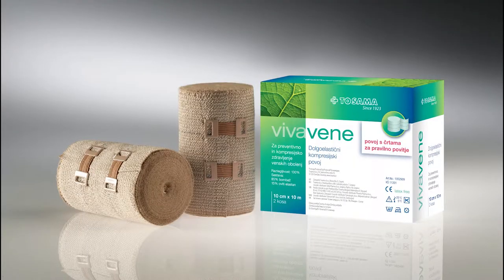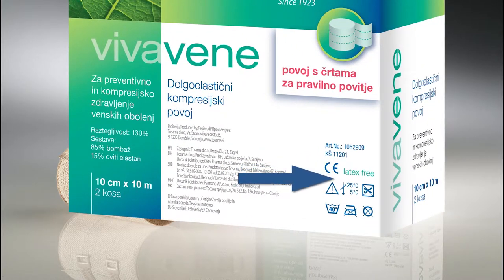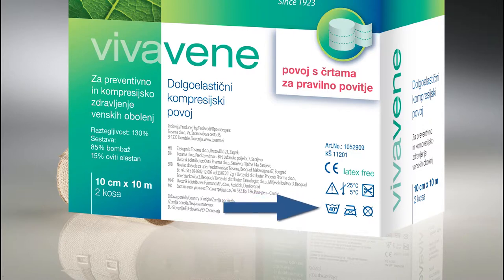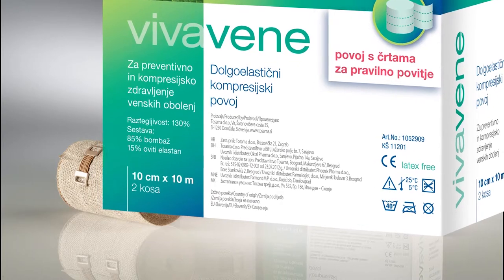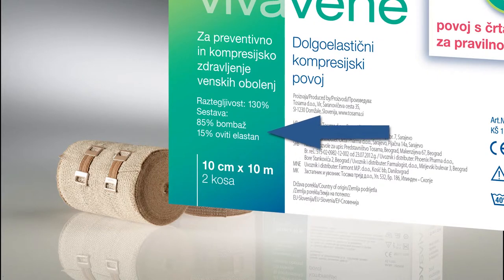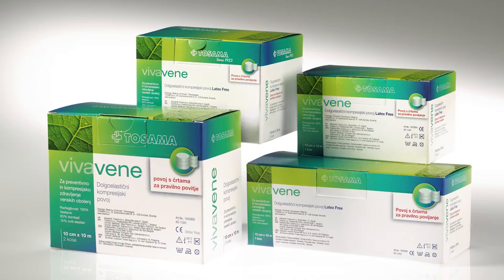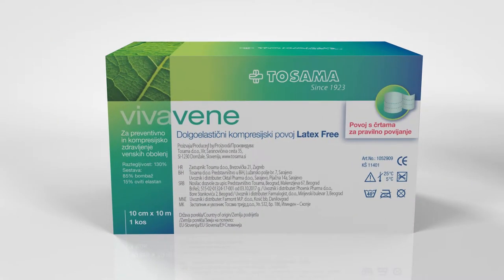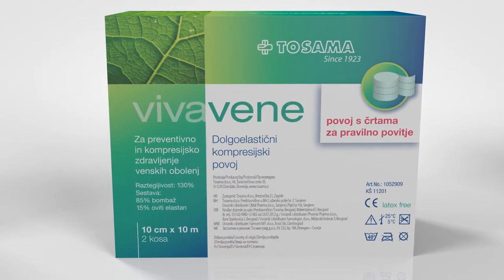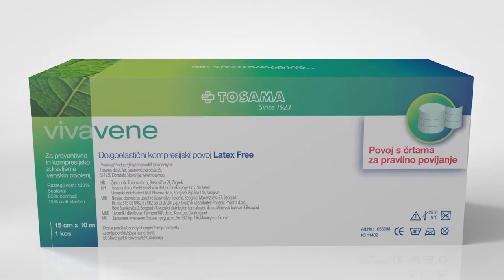VivaVane keeps its long-term compression with regular daily use for two to three months. The bandage does not contain latex, can be washed at 40 degrees centigrade, and has glued edges. The bandage is made from user-friendly materials: cotton and a smaller proportion of Elastane. The extensibility of the bandage is 130 percent. Bandage sizes: 10 cm x 10 m per pack, 10 cm x 15 m, and 15 cm x 10 m.